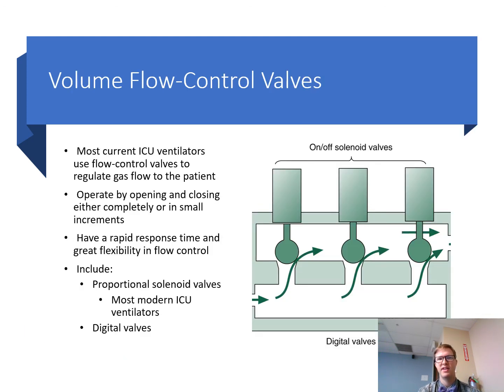Current ICU ventilators use flow control valves. So flow control valves regulate gas flow to the patient. So instead of just a sine waveform all the time, now we can regulate the gas flow and change it to different patterns. So we can customize the interface with the patient a lot better.